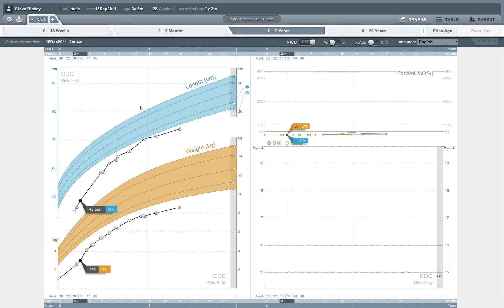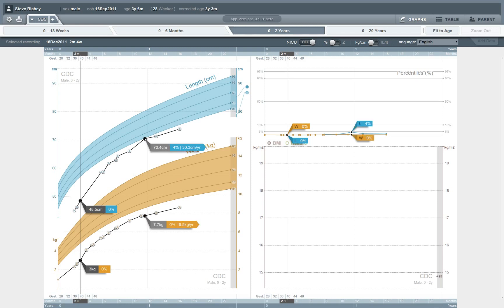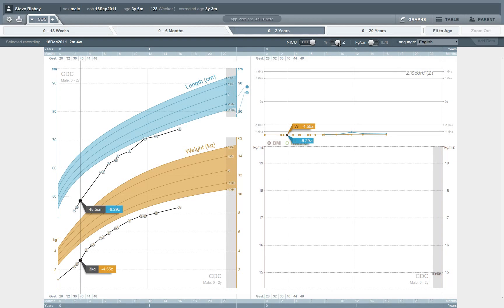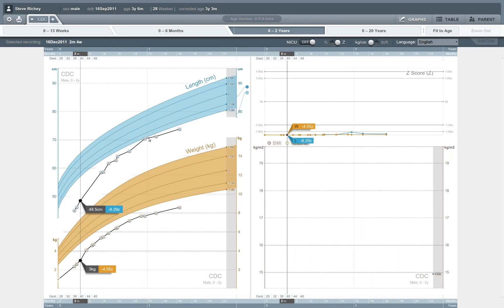Just to point out a couple more of the advanced clinical features of this application, the application allows clinicians to view data in terms of raw values like centimeters and kilograms, or when we're making decisions about whether a child is normal or off the charts, it's sometimes useful to think in statistical terms in terms of standard deviations from the norm. And so we can actually switch modes and look instead of looking at raw kilograms and centimeters. Now we can see in terms of Z score. So this child is 1.73 Z's below the norm.